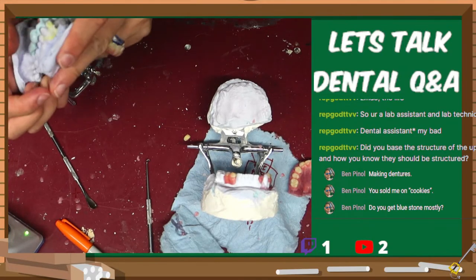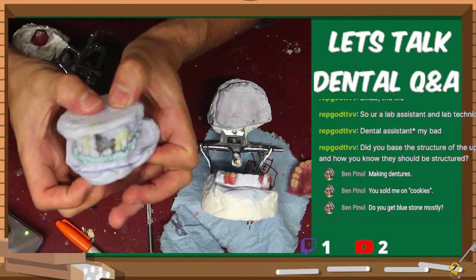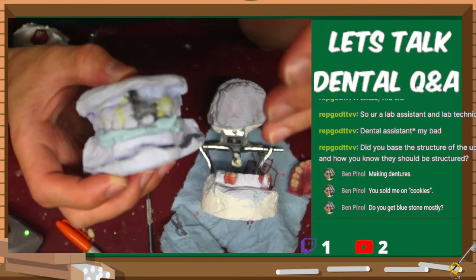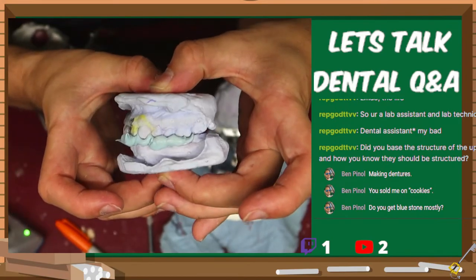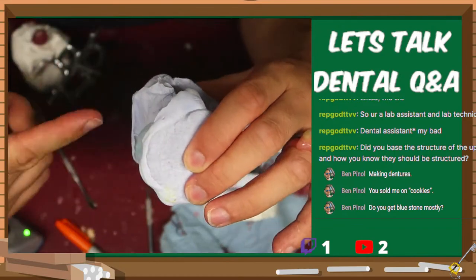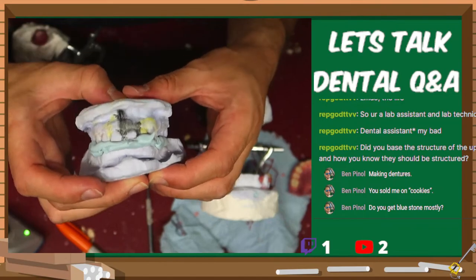This is another set where I made this person retainers. Yeah, this goes here. And so with this, now that I have the correct bite registration for this model, the exact bite of how this person actually chews down on it, I can wrap this with a rubber band so it keeps in this biting state.